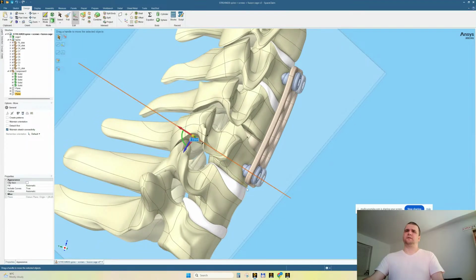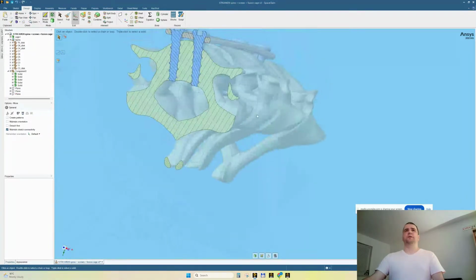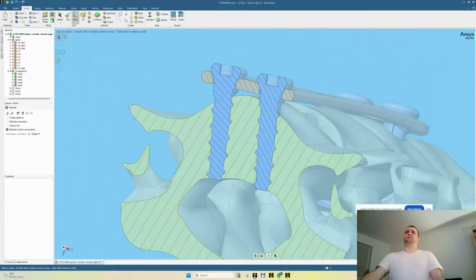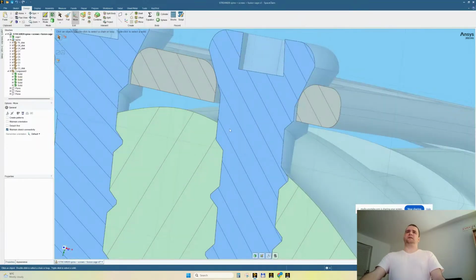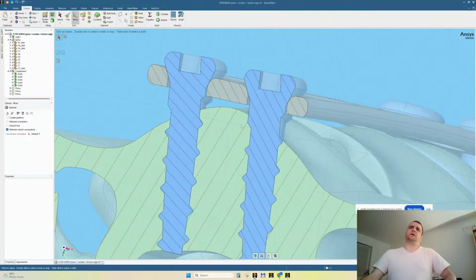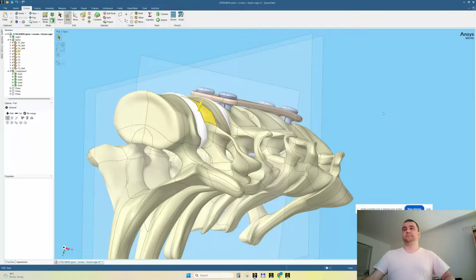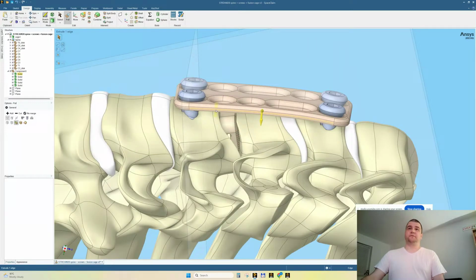Section view about this axis on this direction, you'll see that the section is very well made. The Boolean operation is very well made. Look here. There is no intersection, there are no remaining bone fragments in the screws. So it looks very nice. Come on, it looks very nice. We have to admit it. Also, comparing to what we have seen 2 minutes ago, oh my God. And this is geometry available for free on GrabCAD.